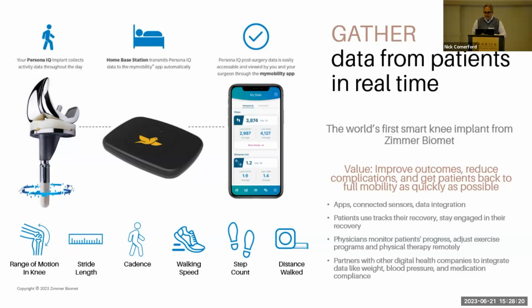But one area that you may not always think about is that middle box, that router, that black box that's now in the patient's home that has to connect to their Wi-Fi. Maybe it has 5G and that simplifies the connectivity, but you have this workflow problem to address. Especially if you were working at Zimmer on a knee device, it's not a use scenario you've ever had to think about.